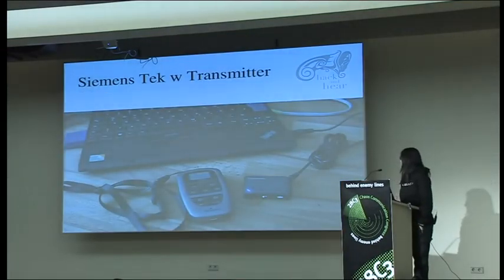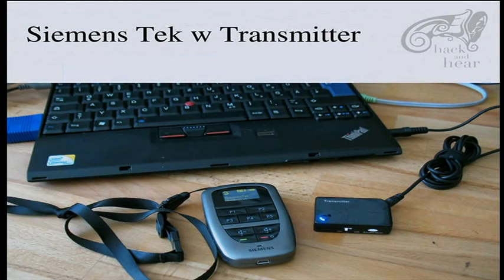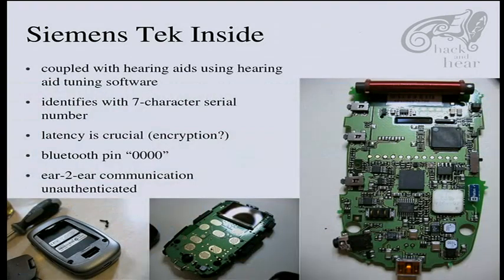This is the setup with a transmitter, so you connect it to the computer and you wear the tech around your head. It also has some buttons for the different programs. Here I said different programs that you can change manually, so that you have one for listening to music, one for your living room, and one for outside or whatever. Of course, I took that apart as well.